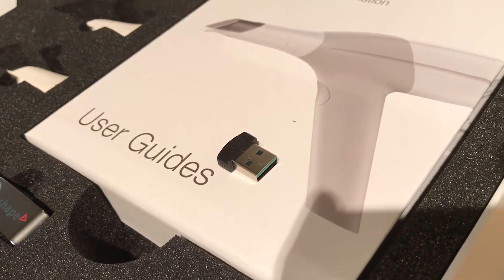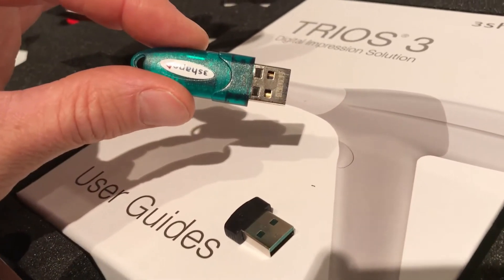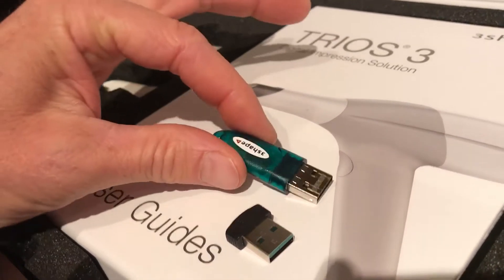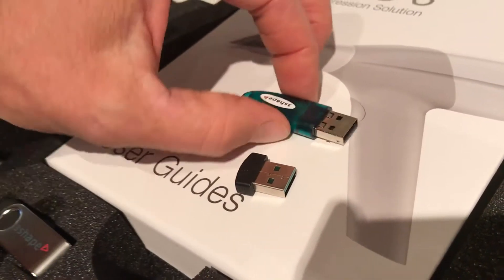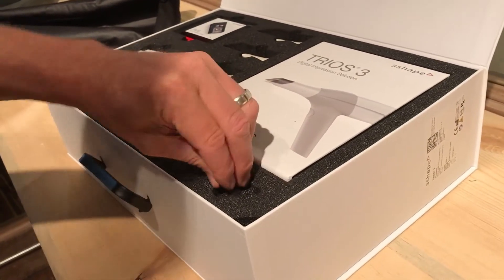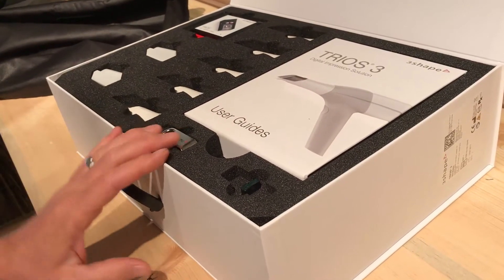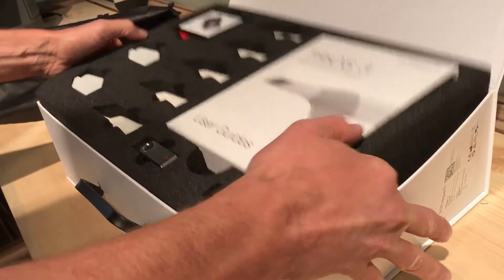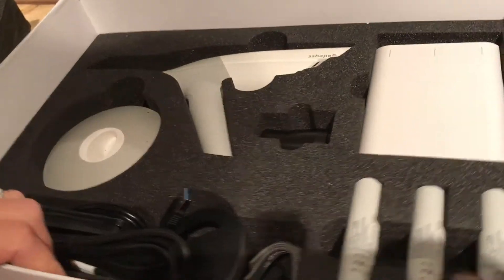So this was previously a production dongle for a Trios or any of the Three Shape desktop systems, and this is actually the new dongle — that's interesting. And this here looks like just a flash drive for data; I believe the PDFs for your Trios are on here.